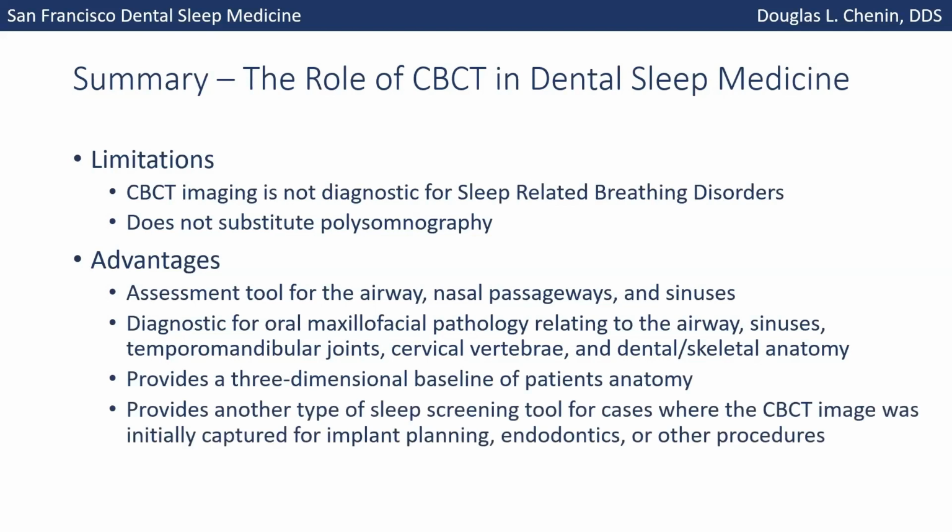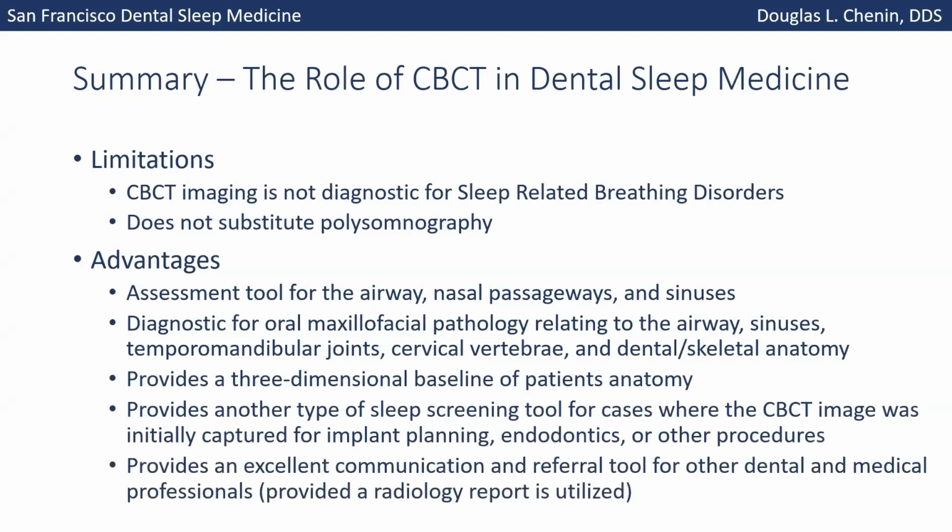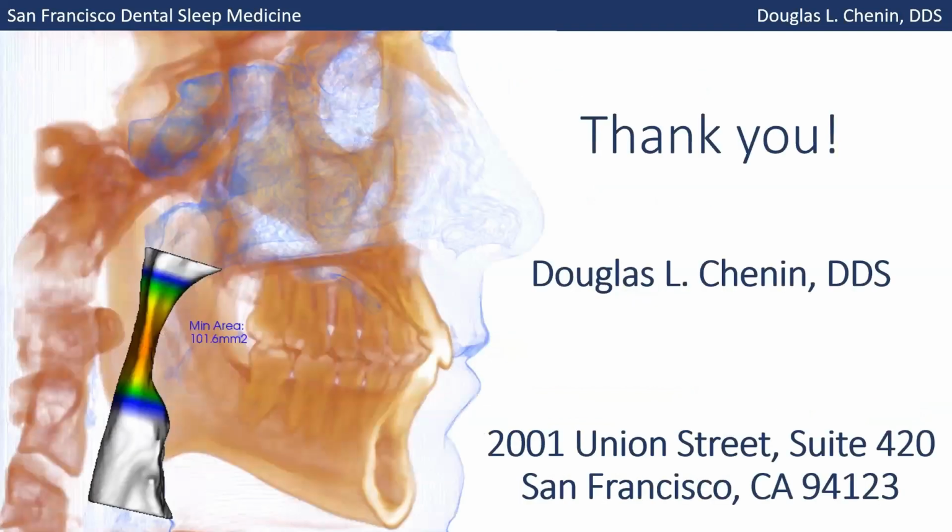It can be a screening tool. In practices where sleep medicine is not the primary focus, where you're doing implants and other things, you might take a scan on someone and then see, oh my gosh, there's something happening in the airway, or swollen tonsils, whatever it might be. In that case, it can be a screening tool and help you find patients that you might have missed otherwise. And it's a nice communication tool as well, and for patient education, both professionally for other doctors, but also just to educate patients themselves.